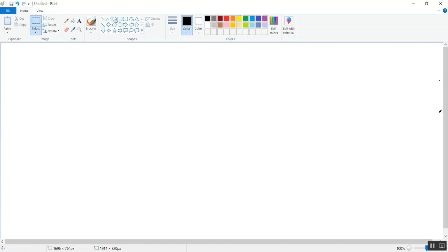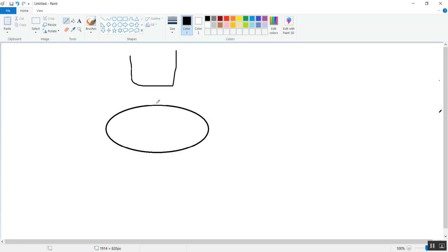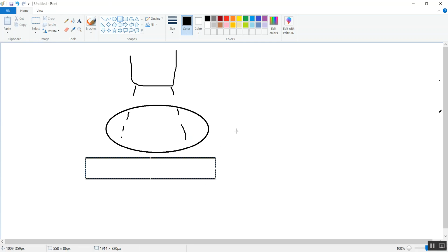So now I have a patient. This patient is exposed to the X-ray tube, exposed to X-ray, and the X-rays are detected by detectors. Okay, these are X-ray photons absorbed by the patient. When I scan the patient in different slices, I get the dose per slice. This is the X-ray tube, this is the patient, and this is the detector.